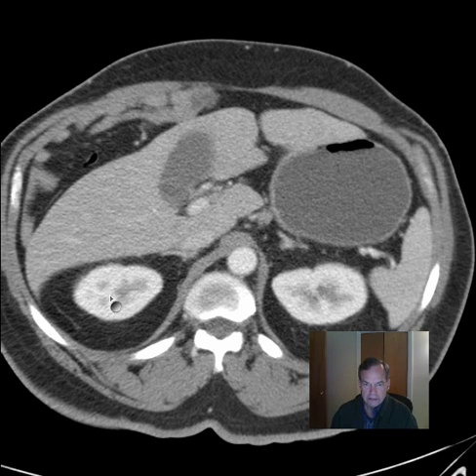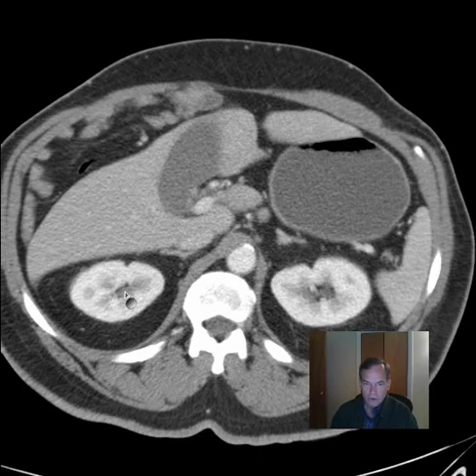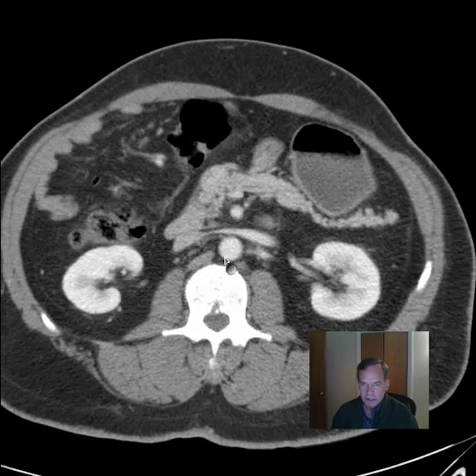The kidneys and gallbladder appear normal. A tiny little defect in the upper pole of the right kidney is noted that looks like it's fat containing. It could be a very small angiomyolipoma or perhaps a small cortical defect, and we're actually seeing some of the perinephric fat in that small defect, but in any case it's not significant. Abdominal aorta appears normal in caliber.